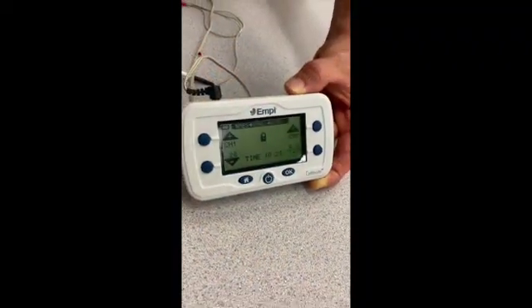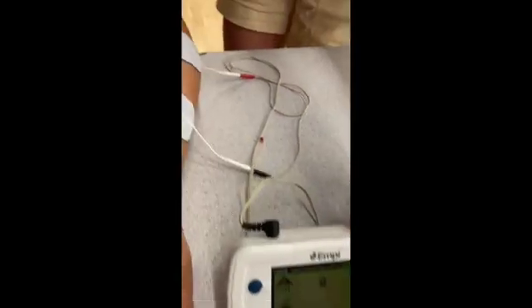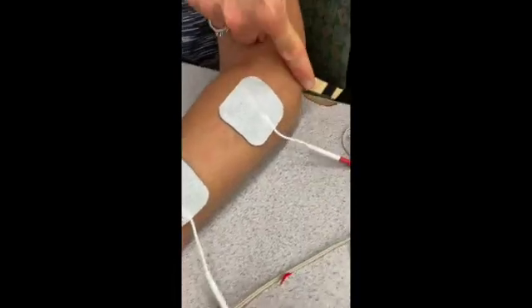In this video, we are using the EMPI device which sends electrical impulses to the muscles to produce a contraction. This shows the settings for this client in order to elicit finger extension.